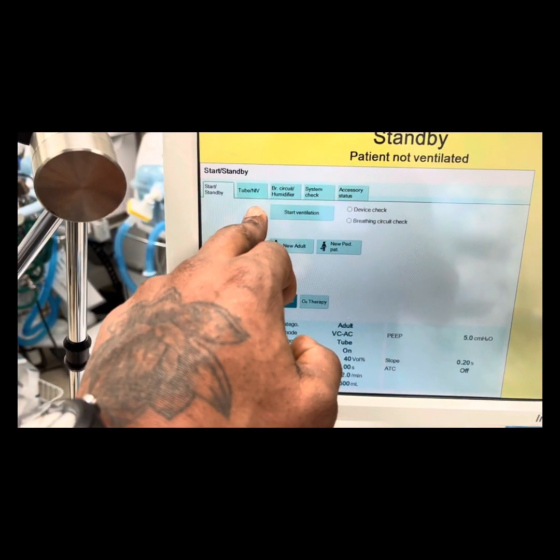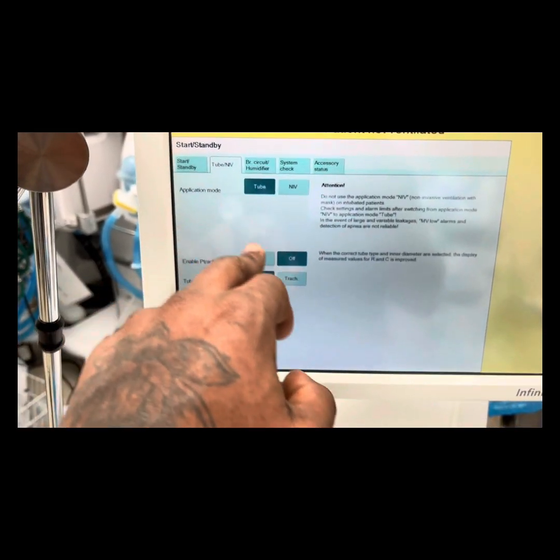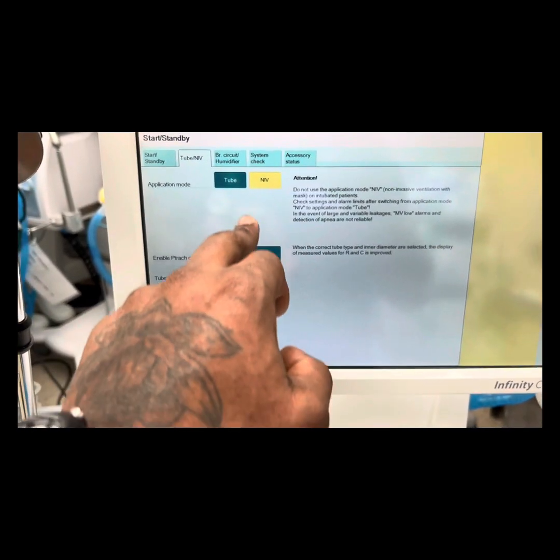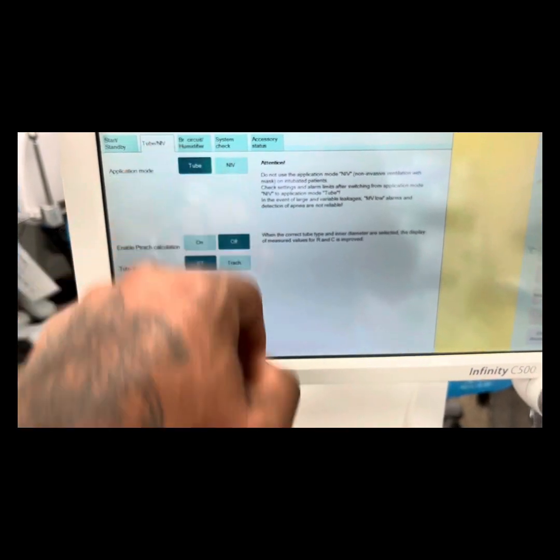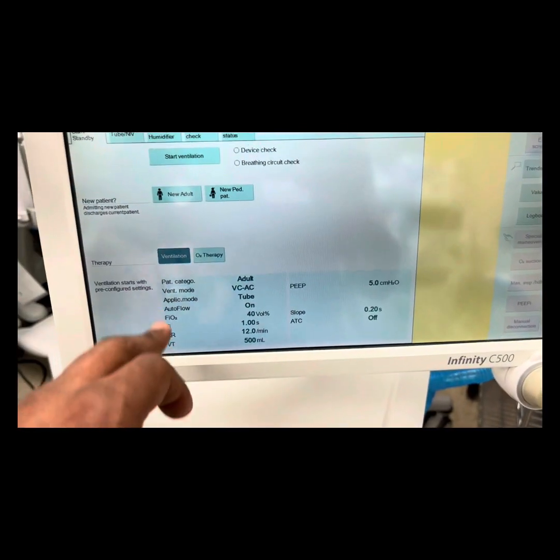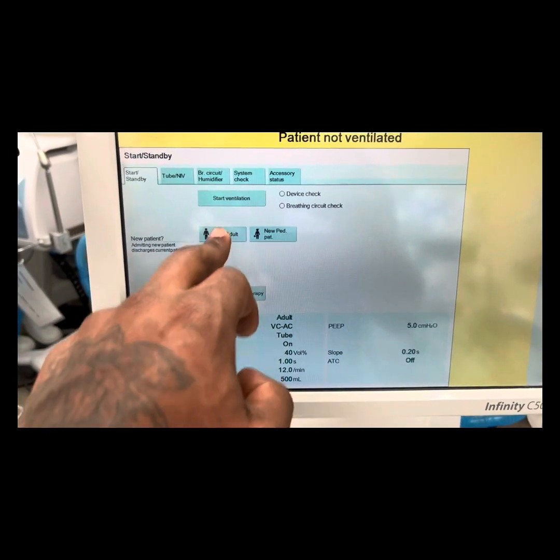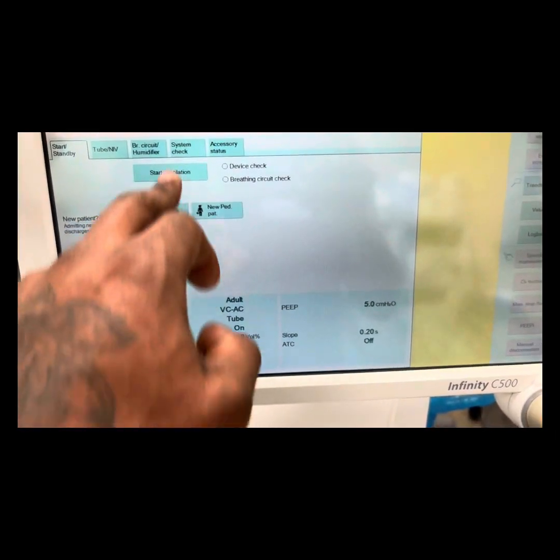Select tube or non-invasive. I'm going to make the standby move. New patient, start ventilation — that's how we get to our settings.